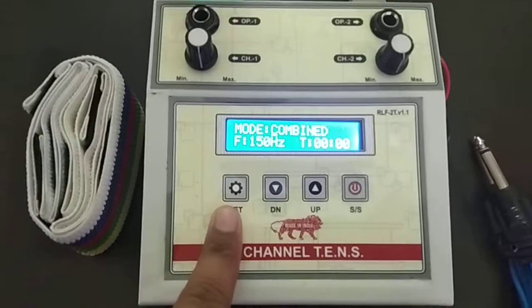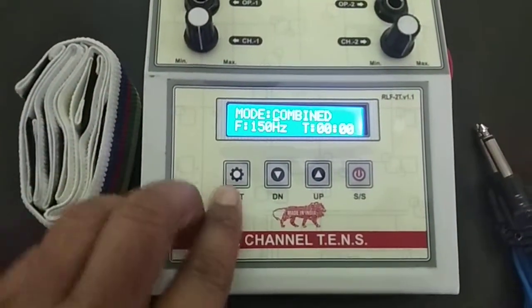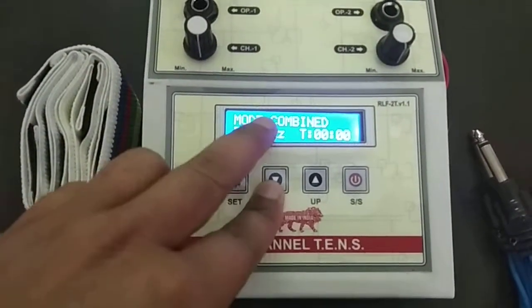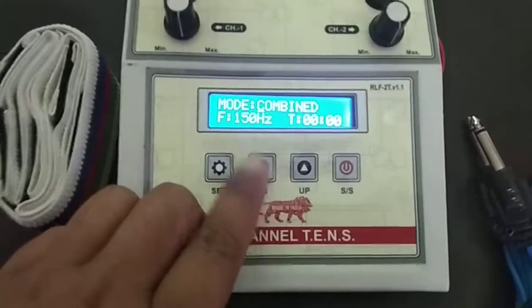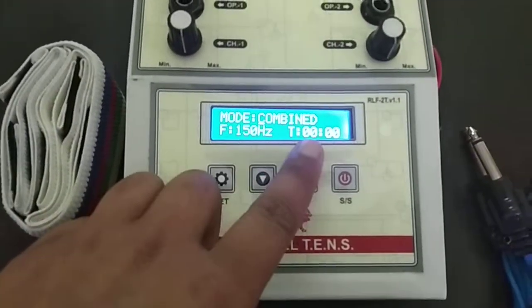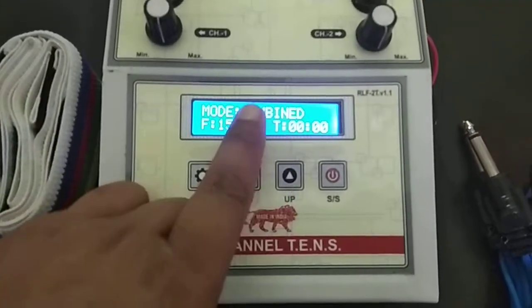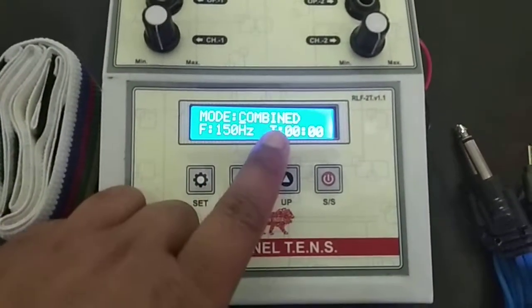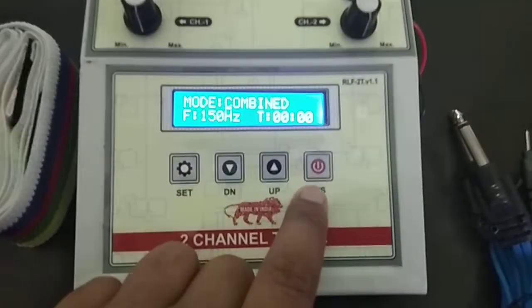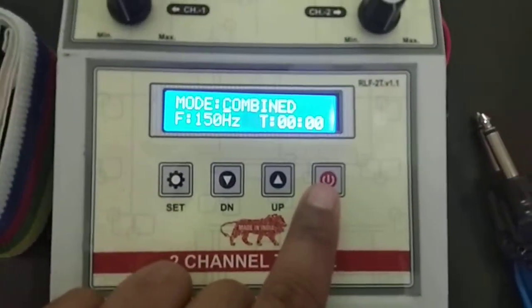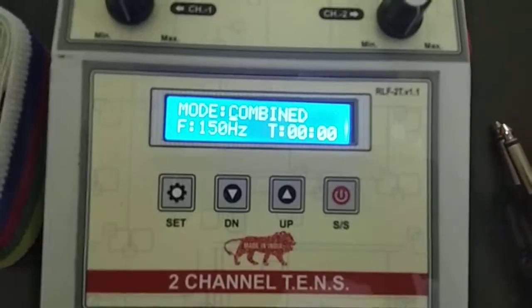This is setting key for setup the programs. This is down key for choosing the programs downward and also frequencies and treatment time. This is up key for selecting programs, frequencies and treatment time upward. And this is start and stop key for starting or stopping the programs.